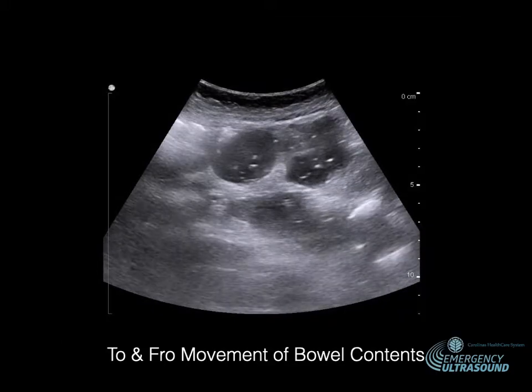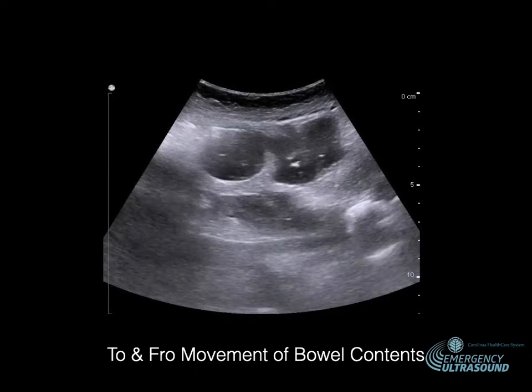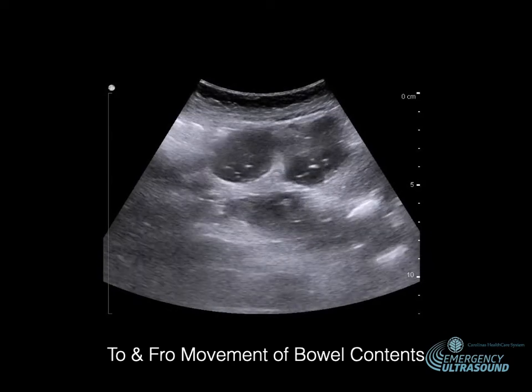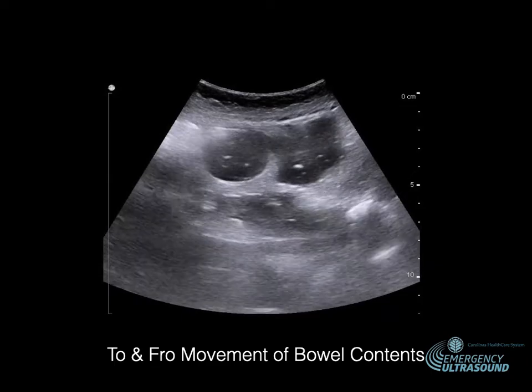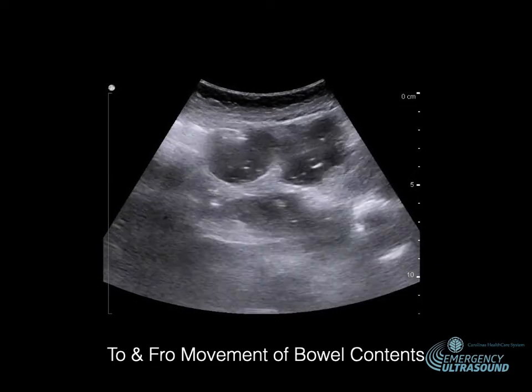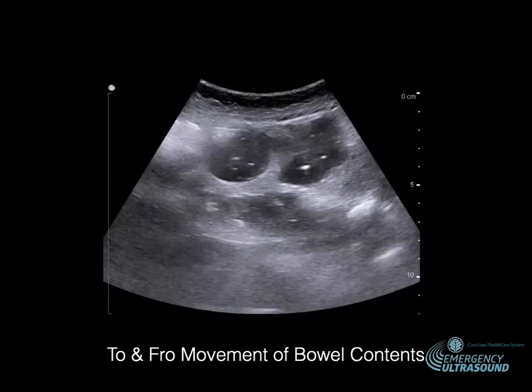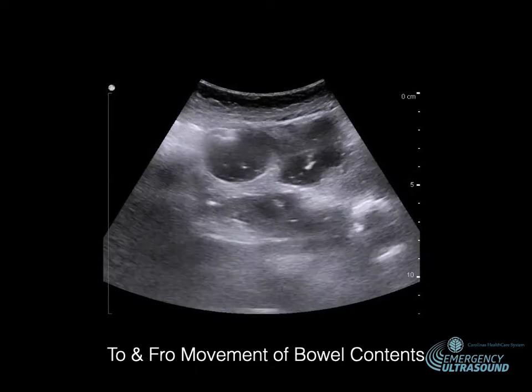Then I want to look at the contents of the bowel. So am I seeing true peristalsis and the bowel contents are actually being pushed forward? Not in a bowel obstruction. So we're going to see to and fro movement of the bowel contents. So we're seeing this bowel is fluid filled, so that's going to look darker or black on ultrasound. And then we're seeing just the white little particles of air, food, bowel contents going back and forth, back and forth.